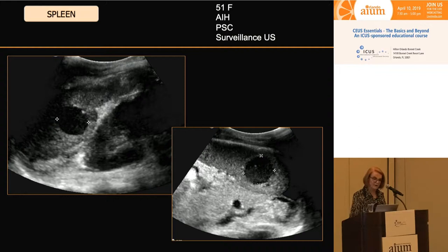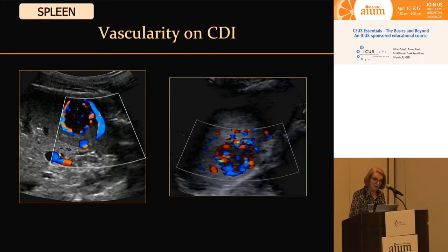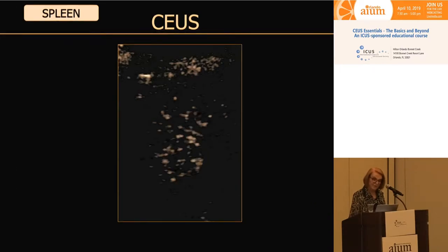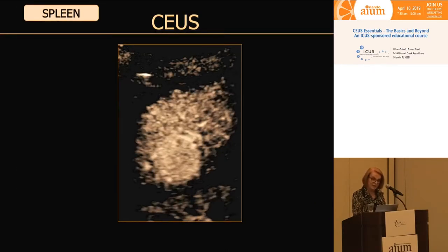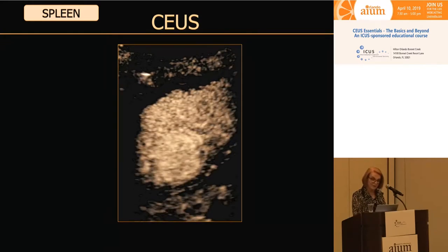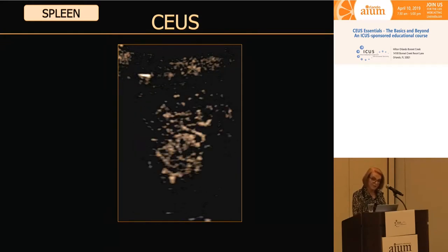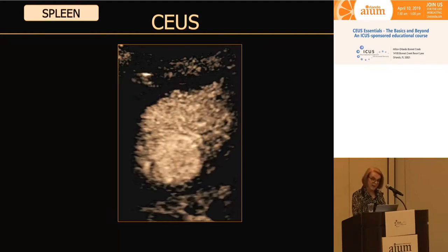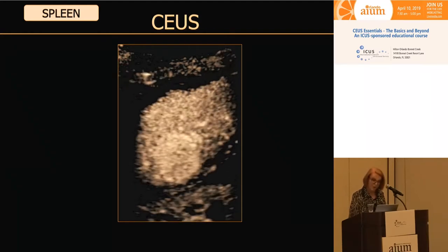Let's look at another patient with autoimmune hepatitis and PSC — a 51-year-old female on surveillance scan. In this very normal-sized spleen, there's a mass that looks quite similar to the previous one: a hypoechoic mass. I really have no idea what this is. With color Doppler, there's both perilesional and intralesional vascularity. On contrast, it kind of fills from the periphery into the center — hyper-enhancing relative to the parenchyma, with homogeneous enhancement.